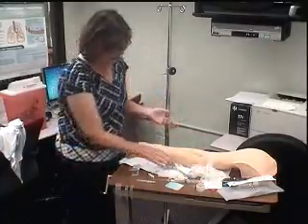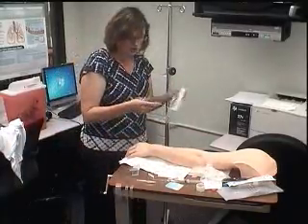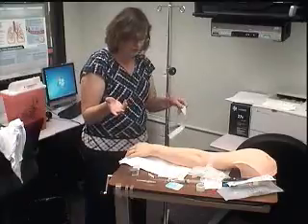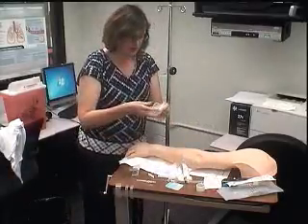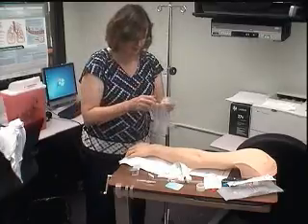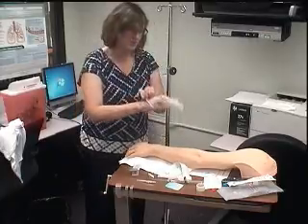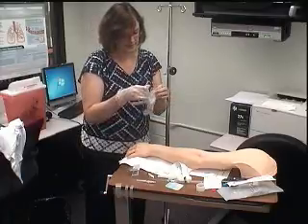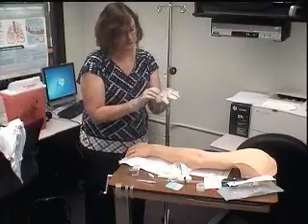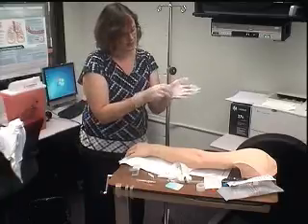All right, before I actually put my gloves on, you can do it with your gloves on or without your gloves on. It really doesn't matter to me, truthfully. Maybe I'll go ahead and put my gloves on first, just to find my vessel. Some people say they can't feel the vessel with their gloves on, and that's okay. If that's the case, then you just put your gloves on after. But I can feel just fine with my gloves on.